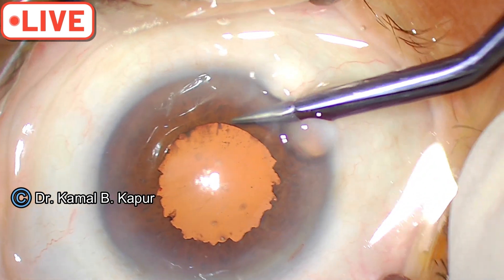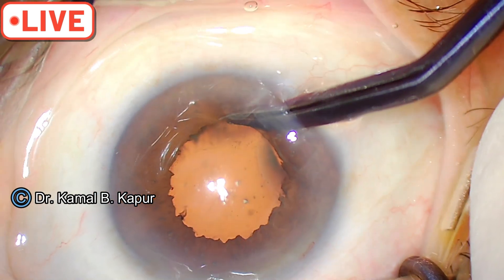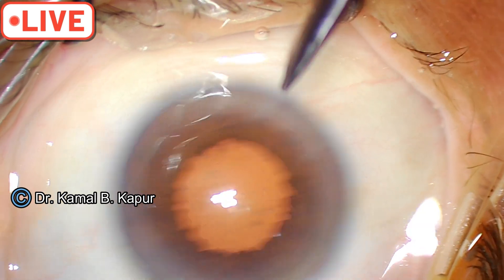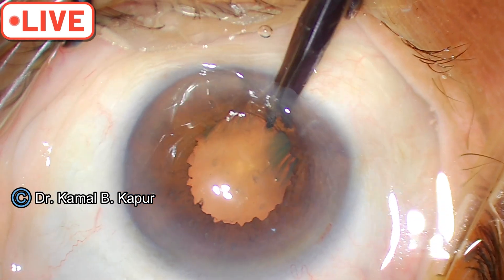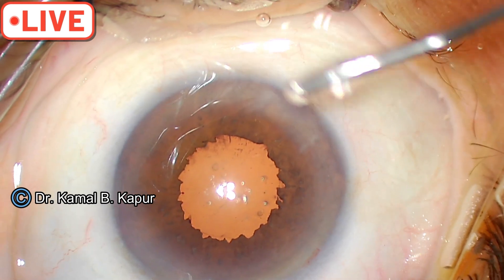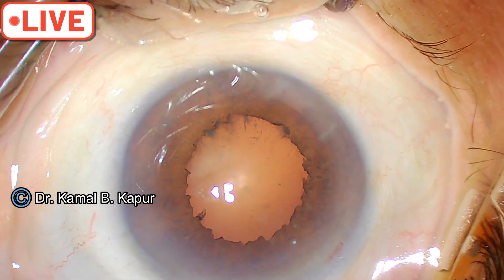Once the pupil comes down to your shape, provided you don't do an over-zealous sphincterotomy. For this you need the patient to be a little cooperative. You can see I am creating the sphincterotomy here. Now we have a near 360-degree sphincterotomy and you can see how the pupil has now expanded, giving me a decent working space.